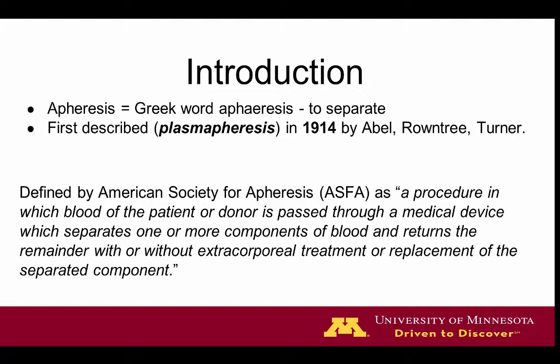So apheresis derives from a Greek word that means to separate. It was first essentially coined in 1914 with the phrase plasmapheresis, and currently it is defined by the American Society for Apheresis, ASFA, as a procedure in which blood of the patient or donor is passed through a medical device which separates one or more components of blood and returns the remainder with or without extracorporeal treatment or replacement of the separated component.